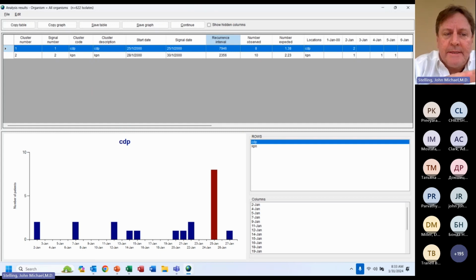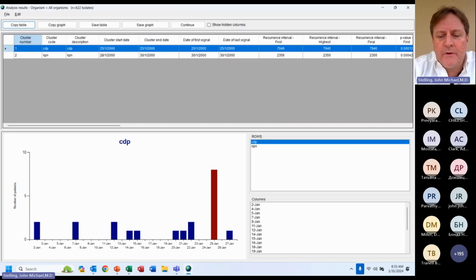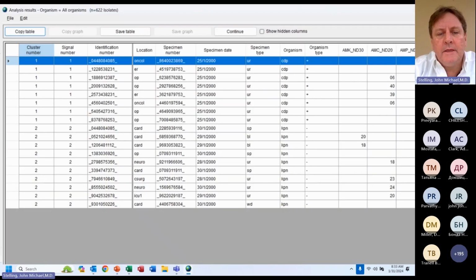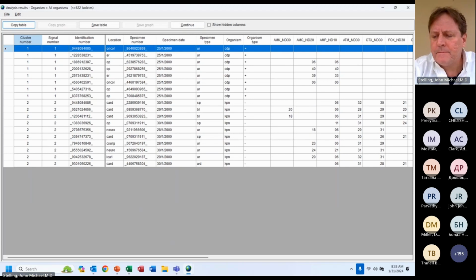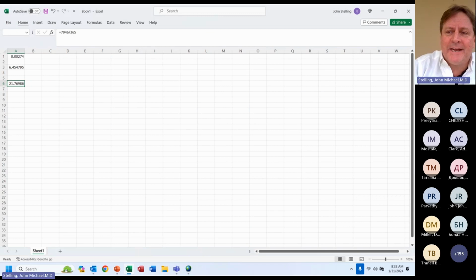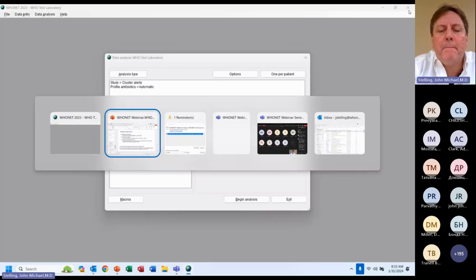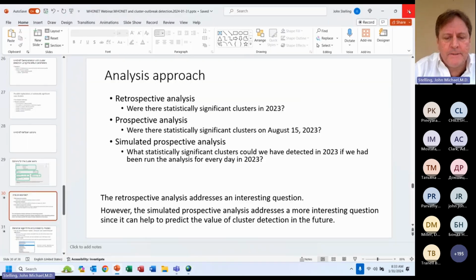Okay, good. This is the detailed report. This is the summary report. And then this is the listing. I will explain later what the difference is between the detailed report and the summary report. It was Excel. Whoops. Good, that's good. And I'm back here.